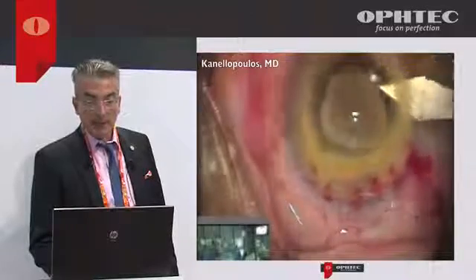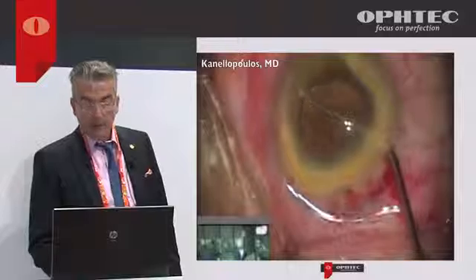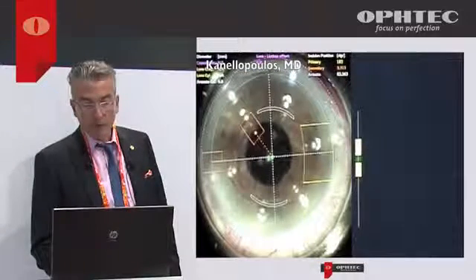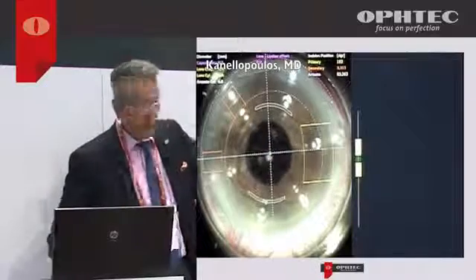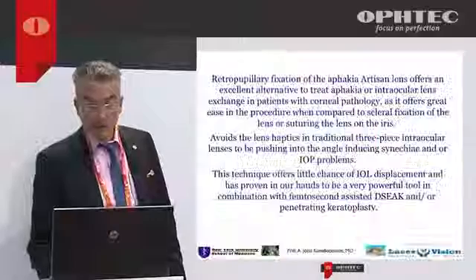And this is, again, an anterior chamber intraocular lens exchange, and again with a femto and astigmatic keratotomy, as you'll see here, due to the high astigmatism and an Artisan lens placement.